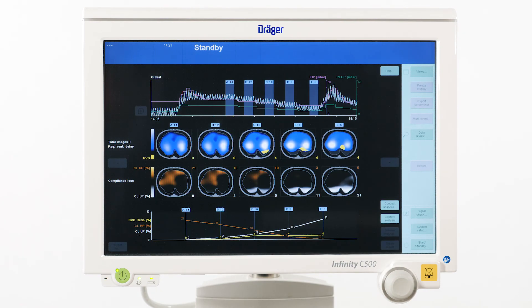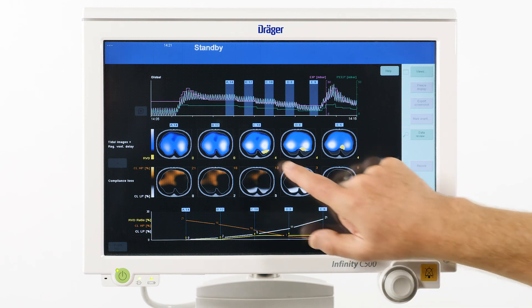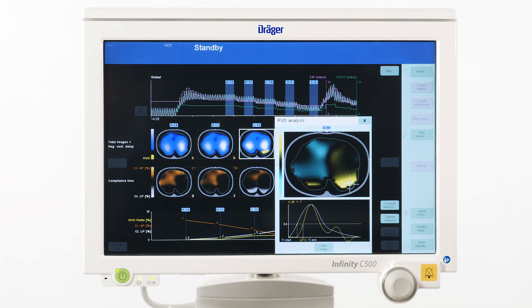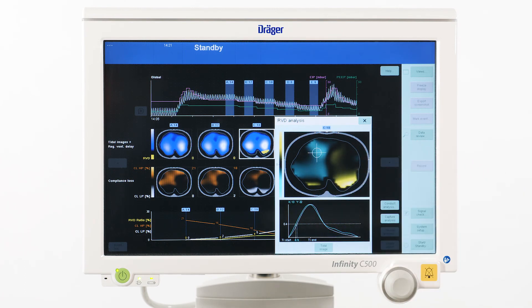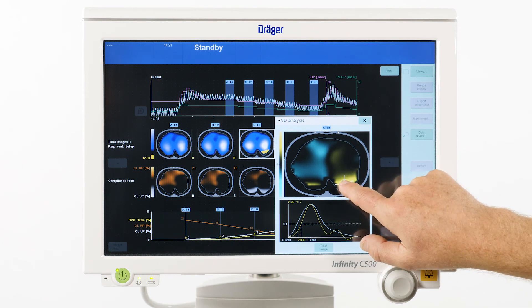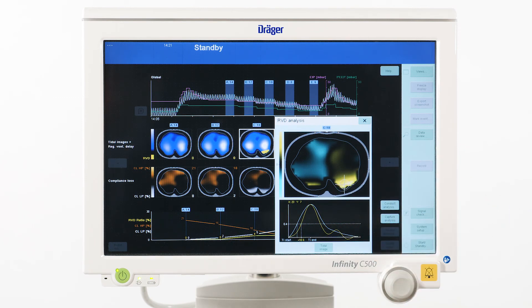In this view, touching the tidal image will open a new window with an RVD map where yellow color marks delayed regions and green color marks those regions which fill faster in comparison with the average. Delayed filling may be caused by either cycling opening and closing or regionally varying time constants.